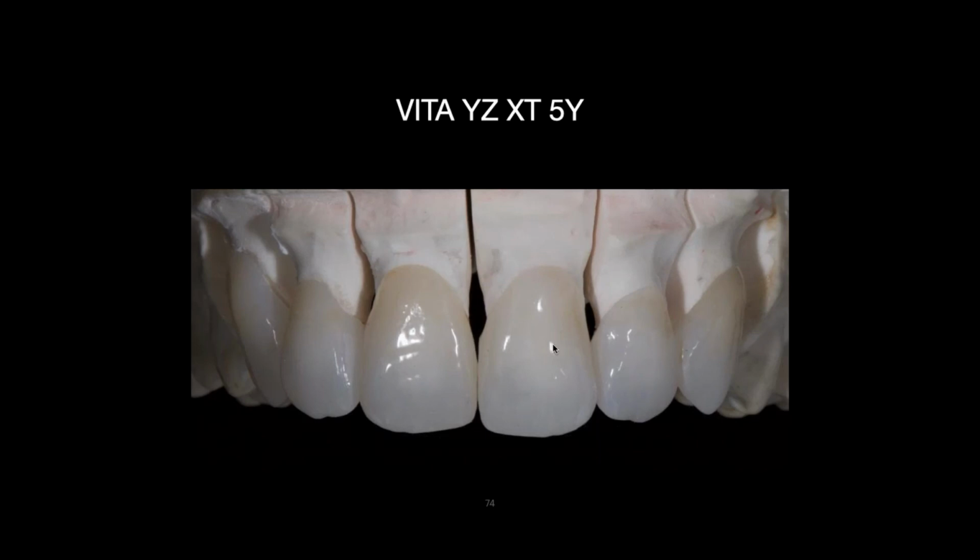They also have, by the way, if you color your liquids, 3 different concentrations of liquid. They have 80%, 70%, and 60%. And if it doesn't come out looking like when you do your tests, like the shade guide, if you want it more chromatic, you use the 80%. If you want it less chromatic, you use the 60. And they have a real nice article on that, you can go to their website, and they have some interesting literature on that. So you can get the translucency right on zirconia to match single anterior teeth.